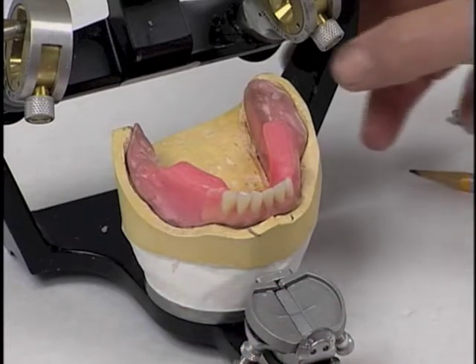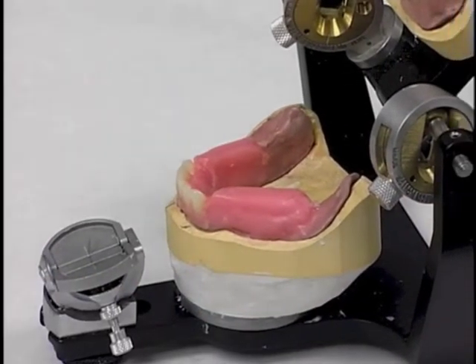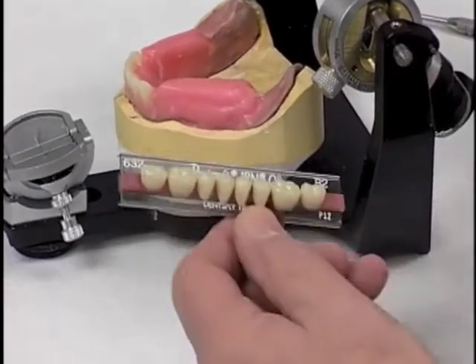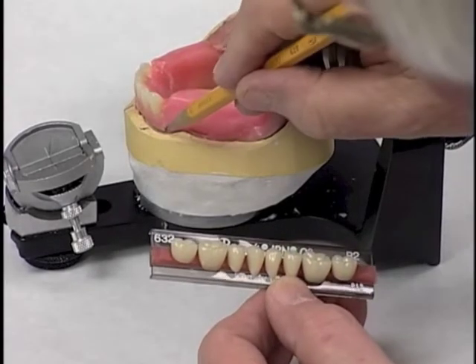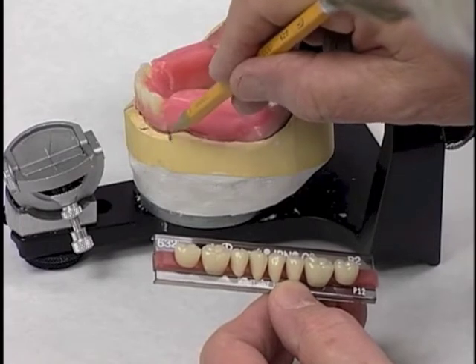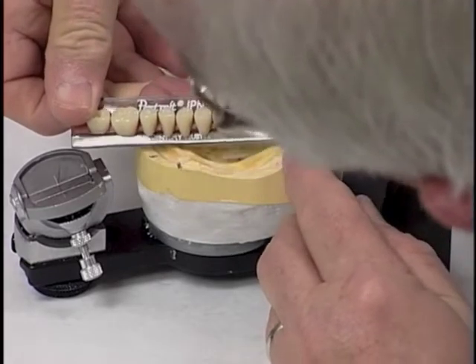Before starting to arrange the teeth, the next thing that we would like to do would be to check with our posterior teeth, and we don't want any portion of these posterior teeth to be on the upward slope of the ridge. So what I'm going to do is put a mark on the facial which is even with the distal of the canine. And now I can remove that base plate, and let's see where the mesial of the first premolar would come out.